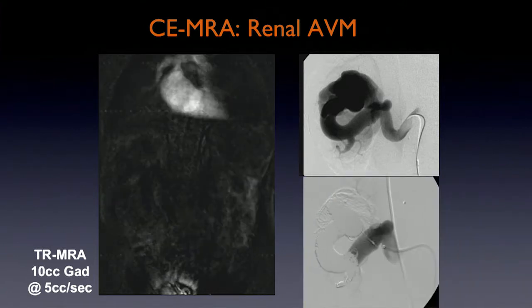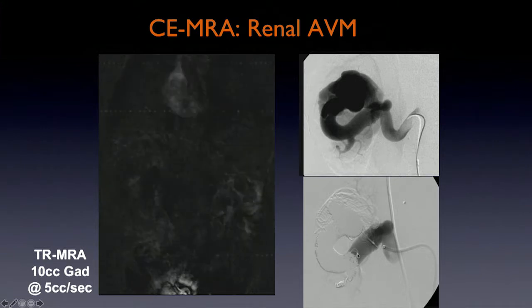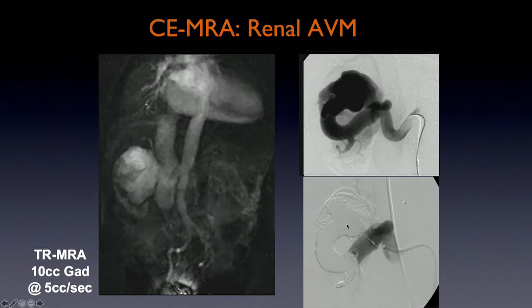And after coil embolization, you can't really appreciate how many coils are in here. There's some snickering out there, but this is actually 2 guide wires in addition to about 15 Nestor coils. So half a Mercedes is stuffed in there to block that up, but it was successful.